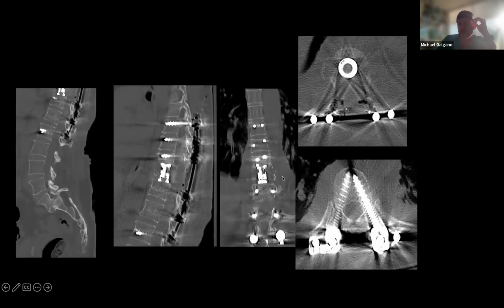Yeah. Okay. And what Zia used to teach me is even if they do subside a little bit, it's not a big deal because you've got pedicle screws above there. And I've seen many cases where it'll subside and it'll just rest on the screw, and the screw is made of titanium. And then at that point, the cage kind of stops moving, right? It's not your ideal post-op situation, but it's certainly not like a five-alarm fire that you have to fix, though. Okay.